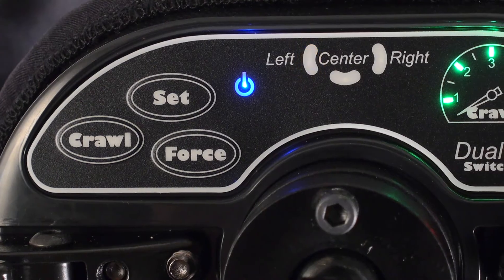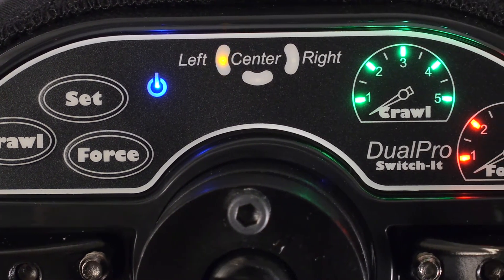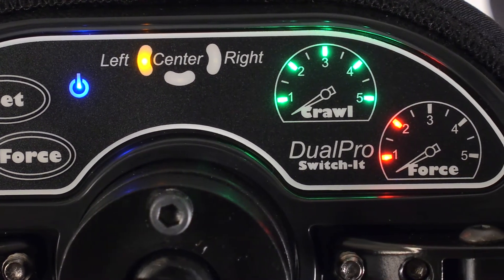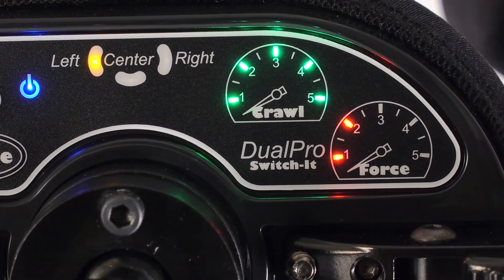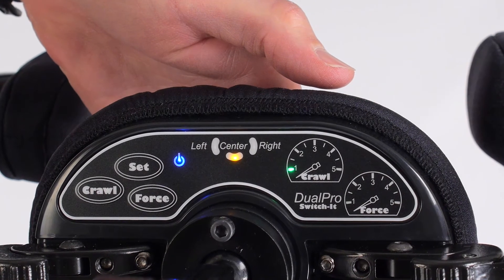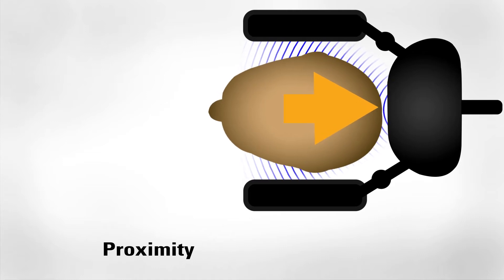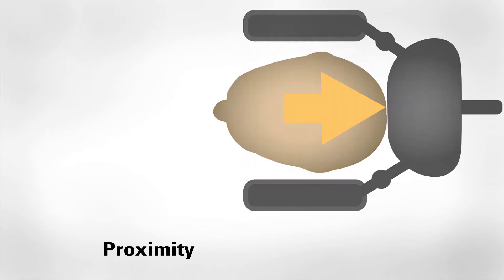In programming mode, a series of green lights may or may not appear in the Crawl indicator, and red lights may or may not appear in the Force indicator. Crawl senses the user's proximity to the pad. Once the user is in range, the proximity will activate at the speed percentage set on the Dual Pro.